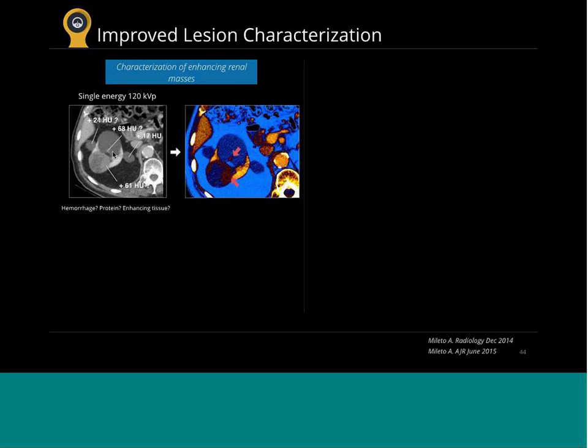I don't know what that is. Well, this one's 17. That's probably a cyst. This one's clearly a cancer because it's 61 Hounsfield units. It's got some mural nodularity. What about this one? I'm not sure about this one. It looks cystic, but it's got a little nodule. Is that blood? These things, even simple renal cysts, like to bleed.